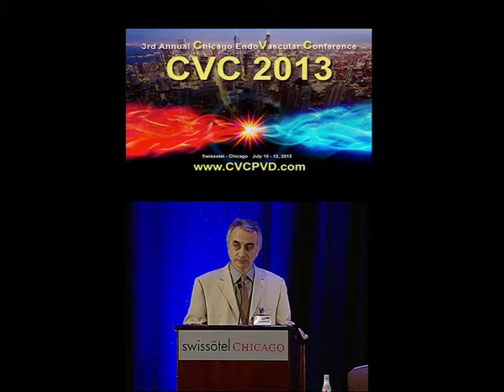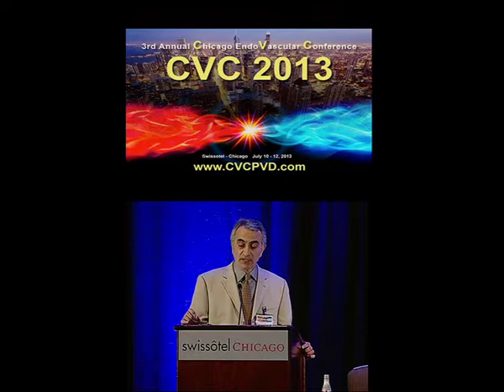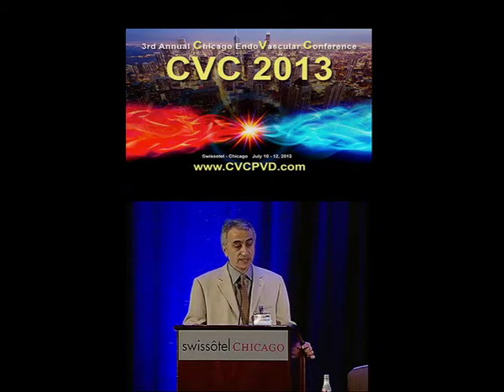The third thing, real quick: what stent grafts are you using, and what sizes are you using them for? The size depends. I use Viabahn most of the time. For the central, cephalic, or IVC? Right. If we use stent grafts, as I mentioned, my experience is only 12 patients. Viabahn most of the time, and you size them to the vessel, obviously. The BARD device is also pretty good. We use Flair for anastomotic issues. The data is actually pretty good on that.